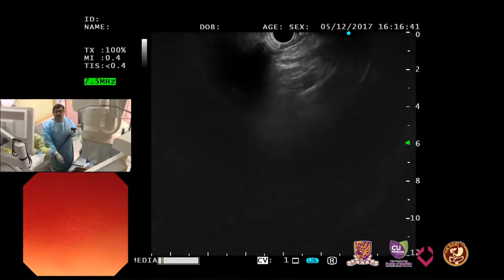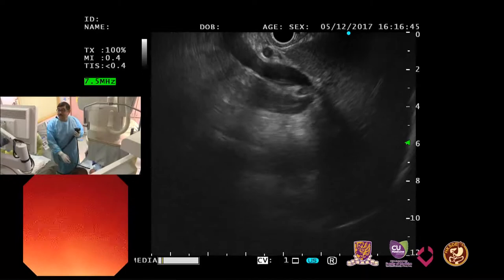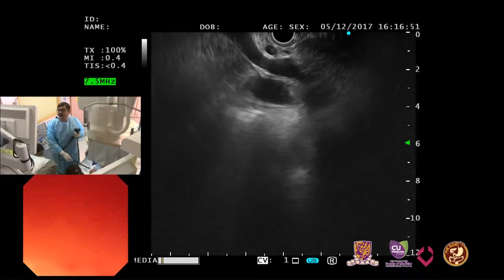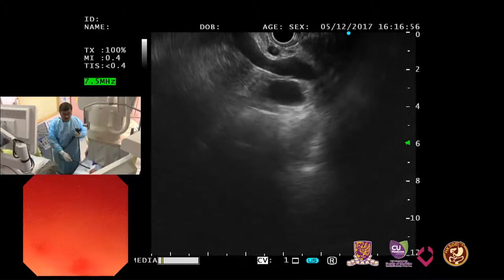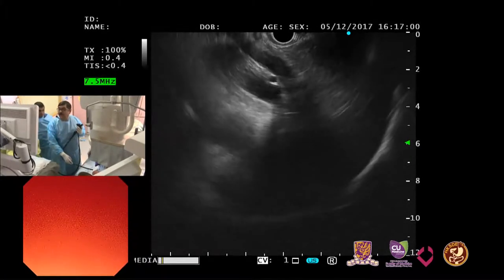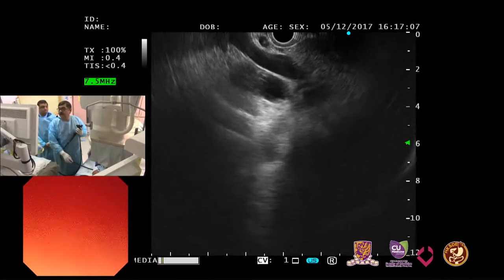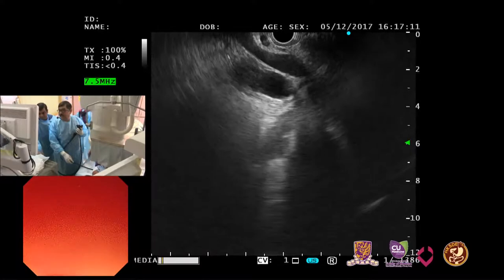I'm a little confused with the diagnosis here, because the patient doesn't have jaundice, and we have a dilated CBD and a definite ERCP telling us that there was a stone in September. So let us first look at what we are dealing with. Here I am, if you can see, this is the liver, and you can see the portal vein and the bile duct. Freeze please, let us measure the bile duct.